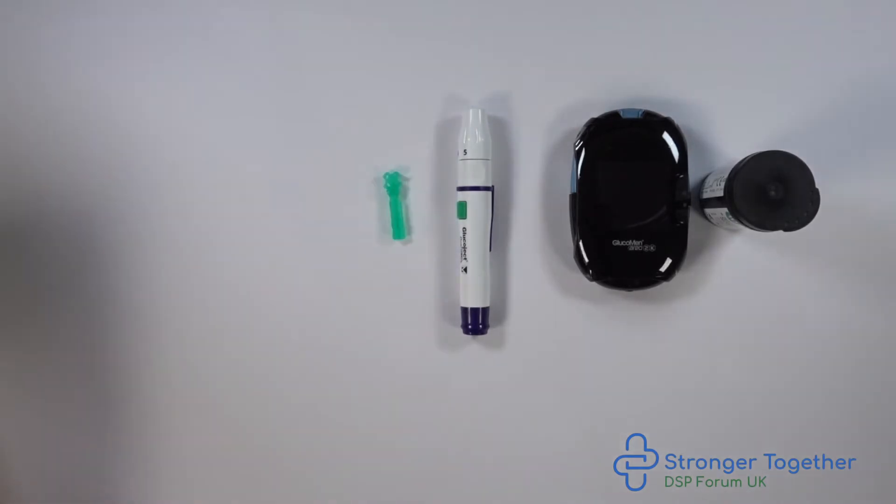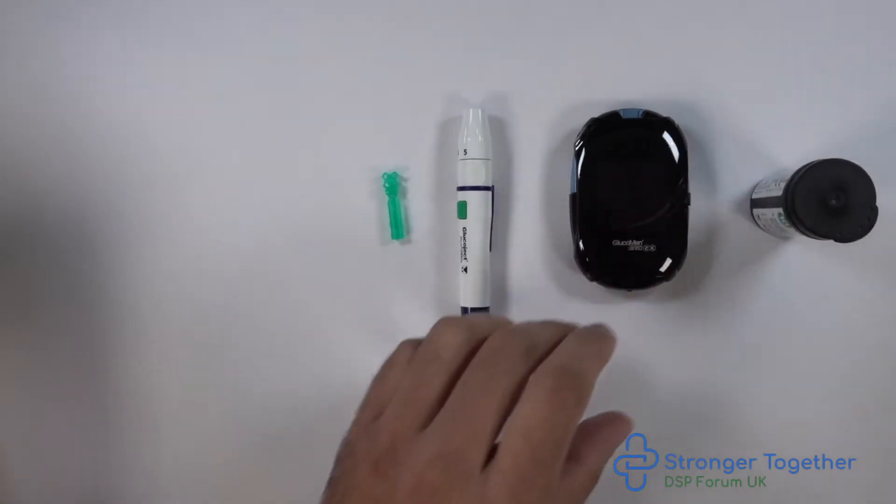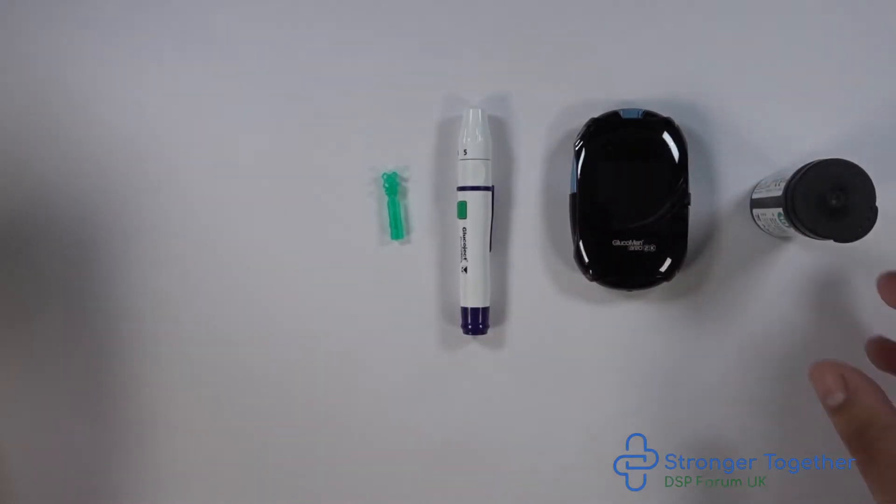Remember to wash your hands with soap and water and then dry thoroughly before testing, as unclean hands can affect your test results. So let's get started.